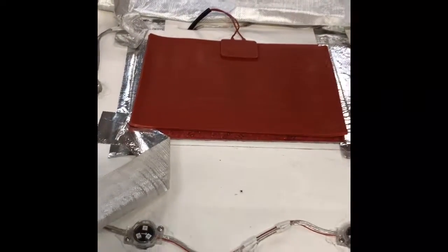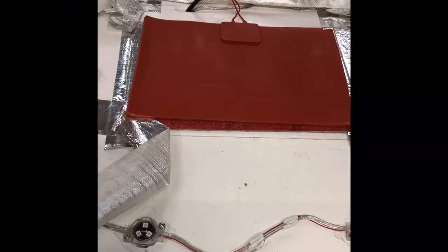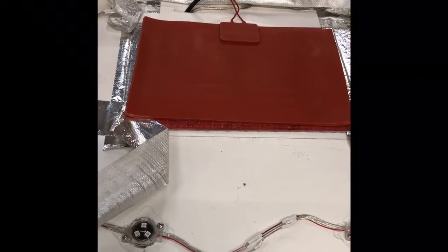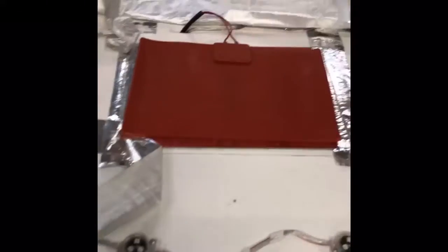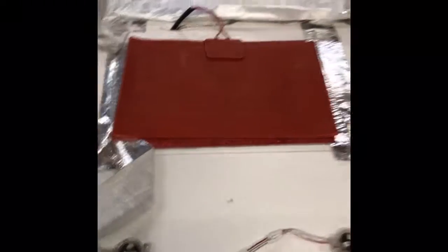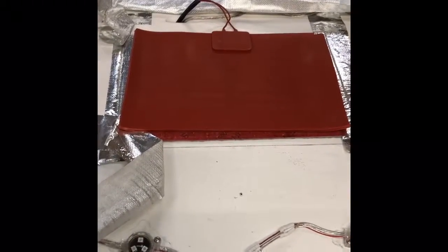So all those parts will be sent out to you, all three of them, so you can go ahead and step by step take it out. First, you just want to start with the fuse. Check the fuse. Hopefully it's the fuse, because that's the easiest way to replace it. Everything's going to be included in that package.